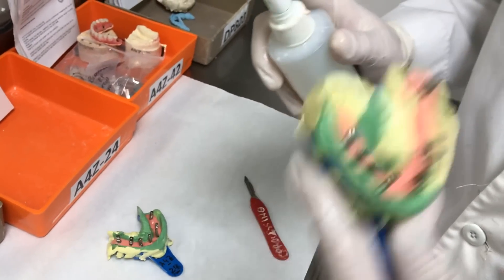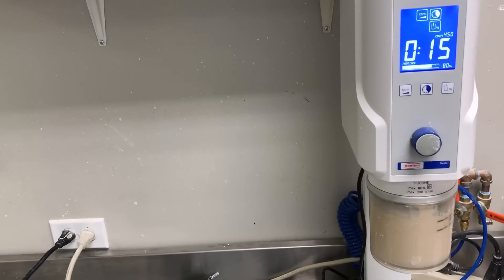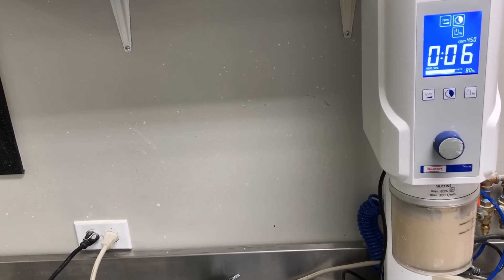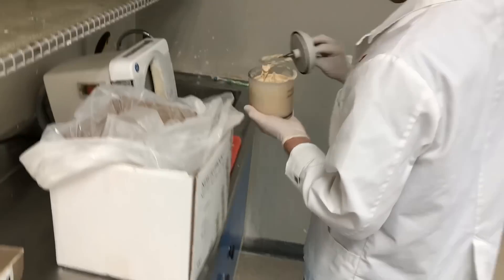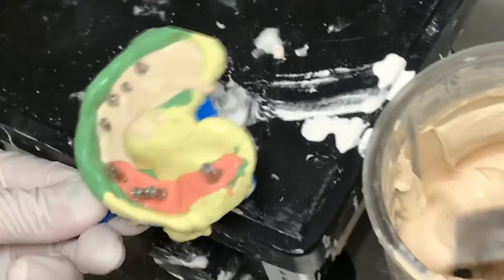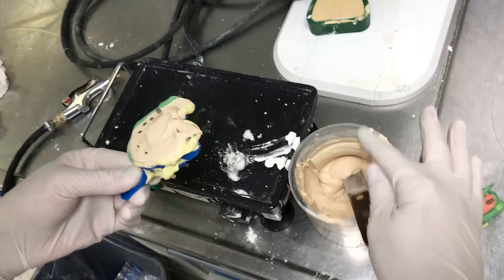In the meanwhile, we put the separator and de-bubblizer. Place it in the door here, about 15 seconds — vacuum is really easy. Then come here with the vibration. It's very important: we cannot put too high vibration because otherwise the implant analogs will move.